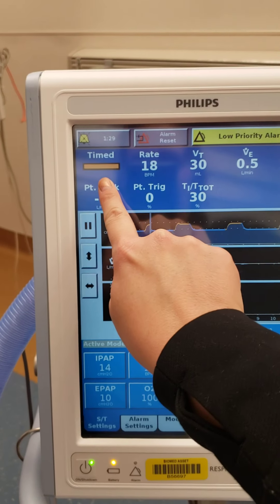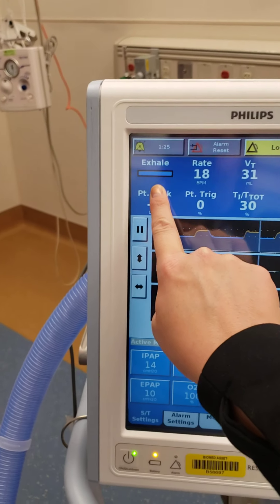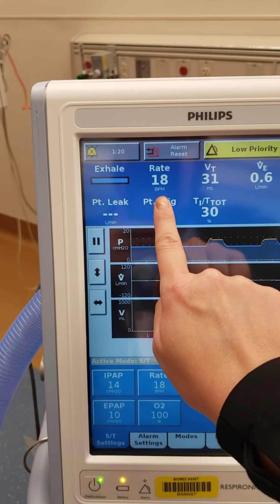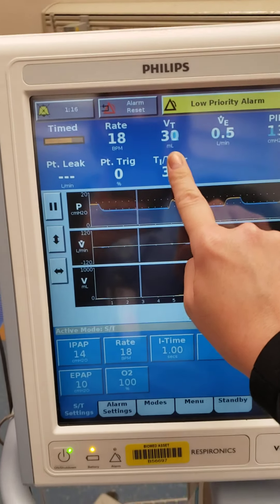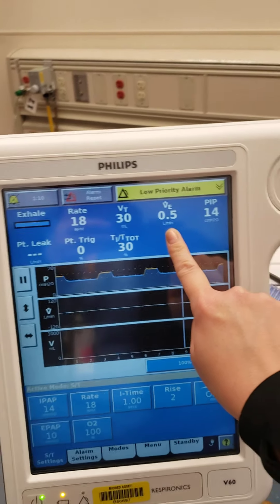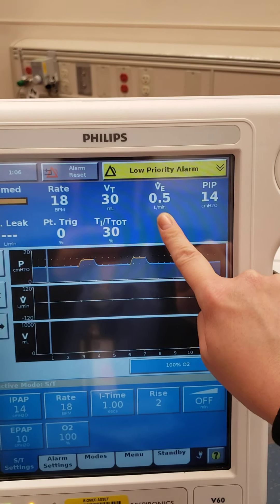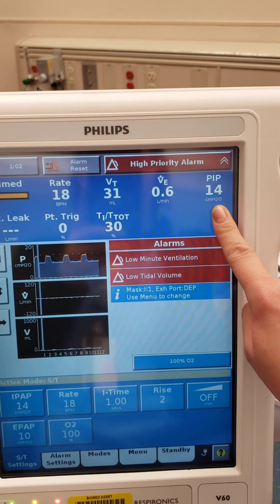Along the top here we can see inhalation and exhalation, or timed. Timed is a delivered breath from the machine. The patient's respiratory rate. Tidal volume — these are bad values right now because we don't have anything attached. Our minute volume — remember, minute volume is rate times tidal volume. PIP is our measured peak inspiratory pressure.